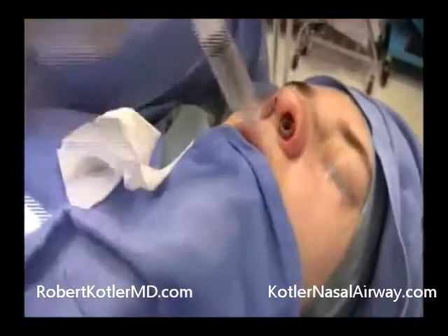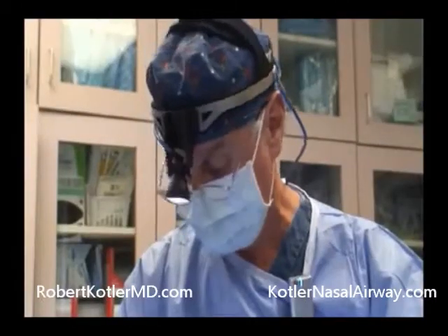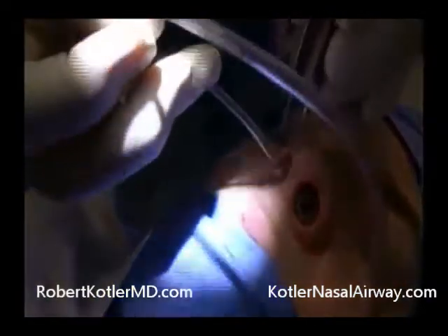I'm going to take some saline and flush it through each of the airways, again to certify that they're clear. Just a little squirt goes through clearly. Next, for a double check, I take the suction catheter, pass it through the airway into the nasopharynx. Helps the anesthesiologist, less of a burden, and certifies again that the back end of the airway is open.